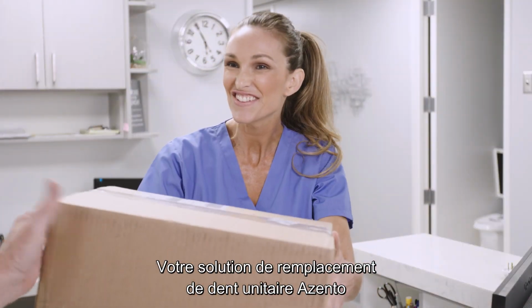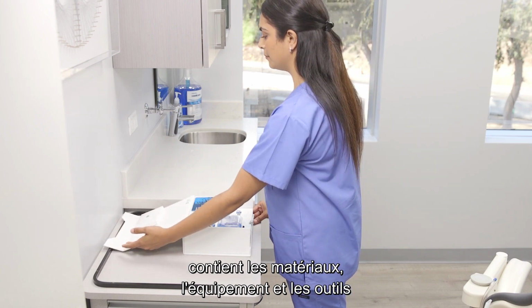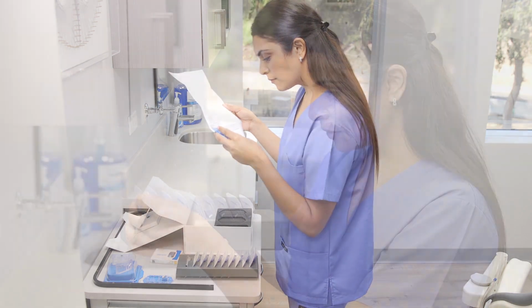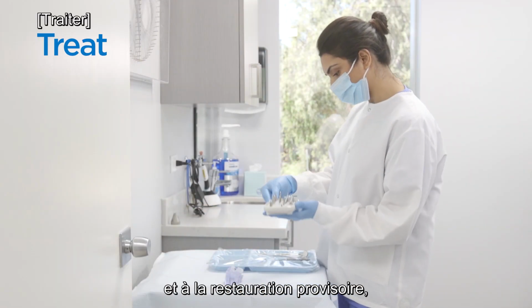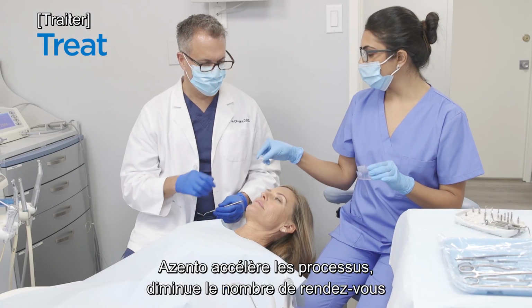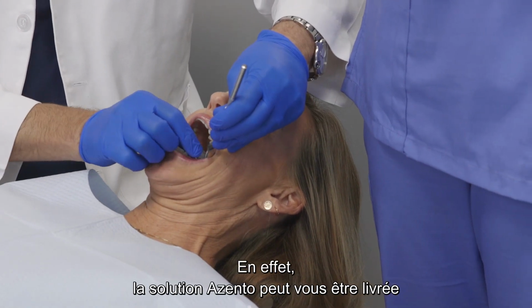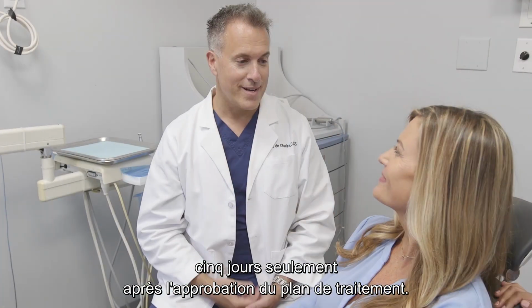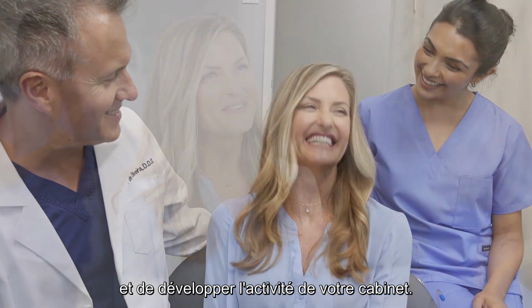Your Azento single tooth replacement arrives with materials, equipment, and tools customized to your patient and consistent with your treatment plan. By efficiently taking you from scan to implant to provisional restoration, Azento accelerates processes, reduces patient visits, and frees up your time. In fact, you can expect to receive Azento a mere 5 days from treatment plan approval, which can open the door to more implant patients and a growing practice.